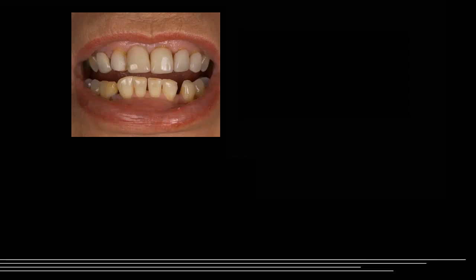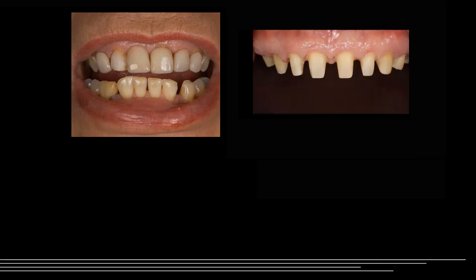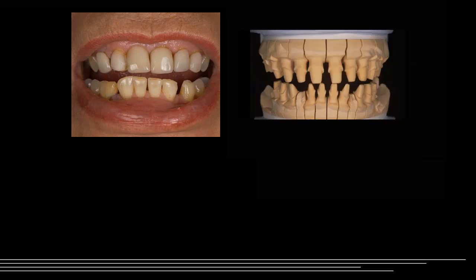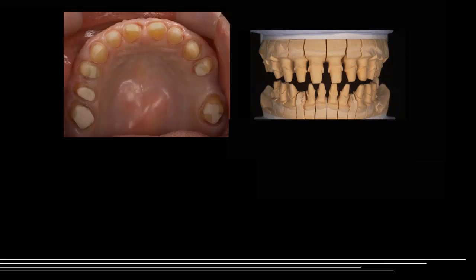So a case like this, got to do a bunch of teeth. In the past, you'd have to bond all these in. And you know how much time it takes to do all this. To take a good preparation design, pack your cords, get a good impression, good provisionals. This is a lot of work. And cementing these in, they're coming for me. Cementing these in would take a long time to isolate each one properly to truly do good adhesion. Okay? That's a lot of work.